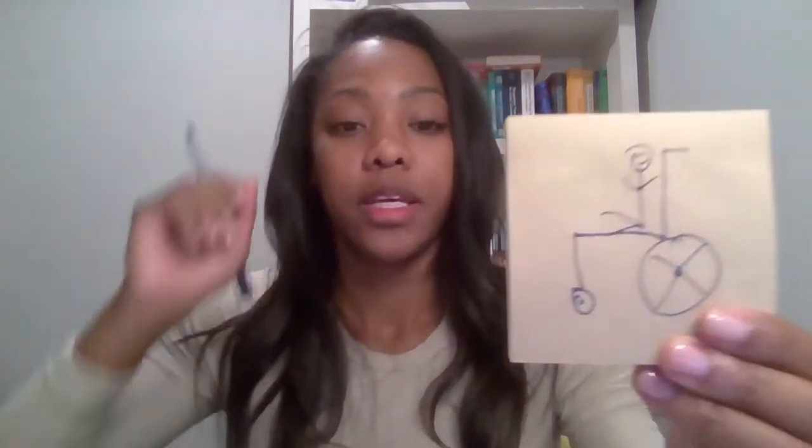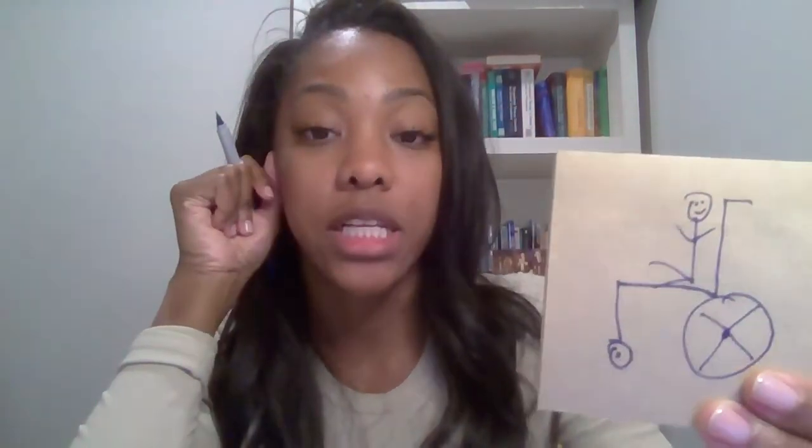But let's talk about the other way. And again, I'm making the drawings or the illustrations a little more dramatic just for teaching purposes. Okay, now where is the client's center of gravity? Where is their weight?